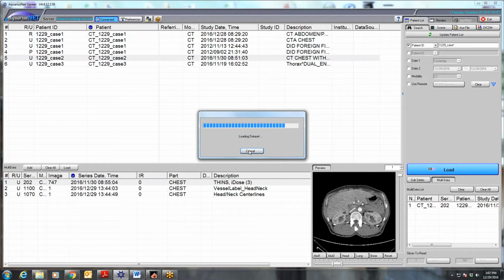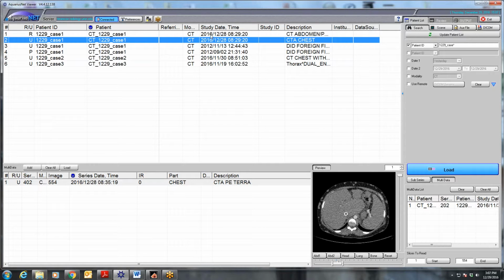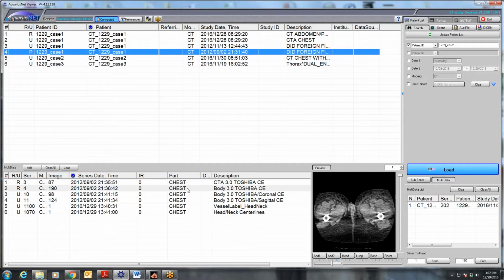So, Seth, why were all the collaterals there from the beginning of life? Why is there this ongoing process of developing more collaterals? Doesn't that suggest something acquired later? Well, she's continued worsening thrombosis.